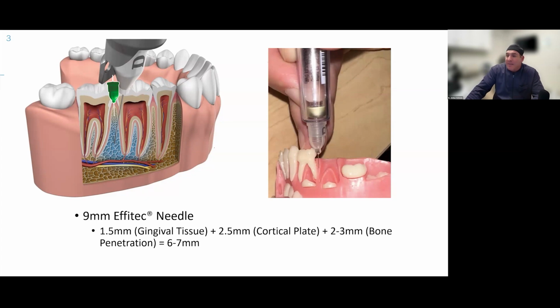I'm pretty much 99% patients under 14, I can deliver osteocentral local anesthetic, and I can profoundly numb that entire quadrant. But for teens, just know that you may have a harder time getting through. You can get through, even 17, 18-year-olds, sometimes adults, but they do have thicker plates, especially if they have larger patients. The bone is just thicker, especially in the mandible as we move posteriorly.